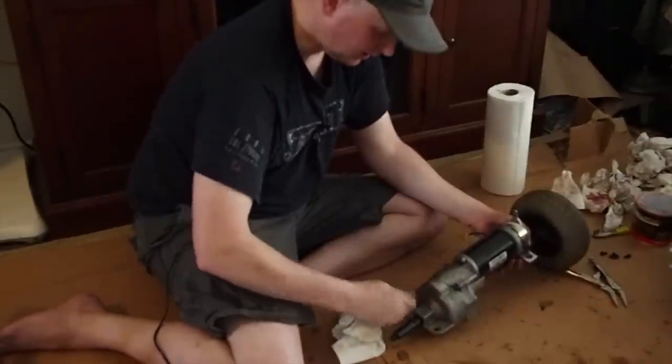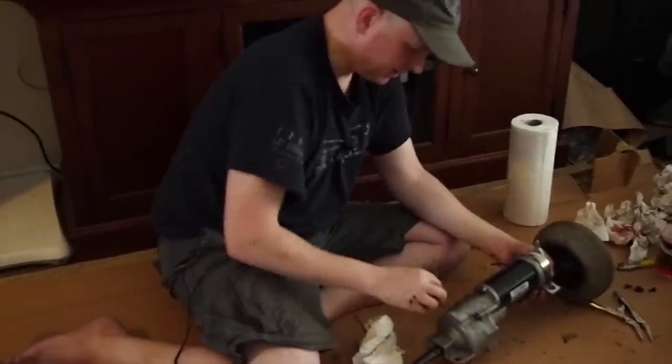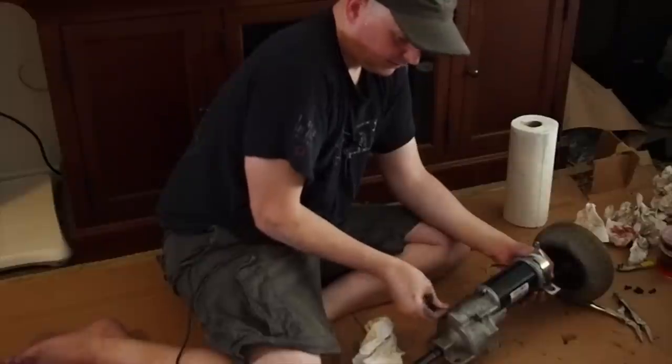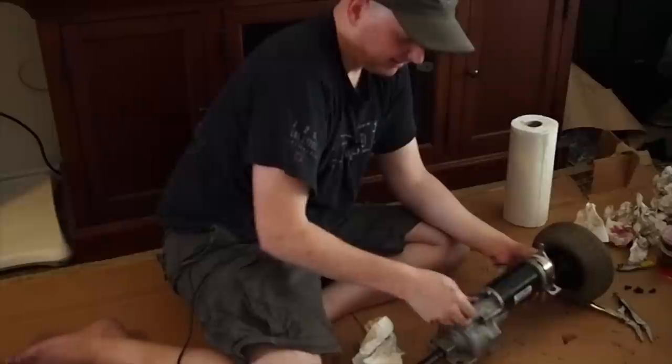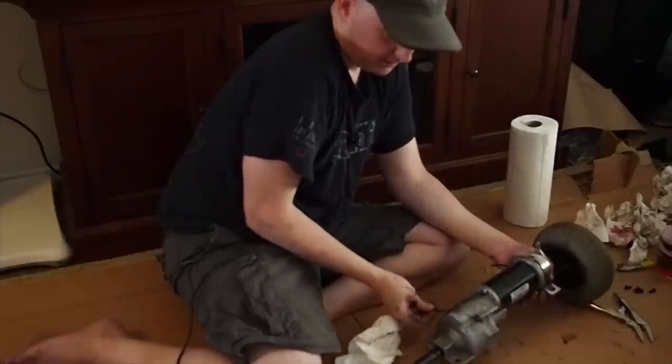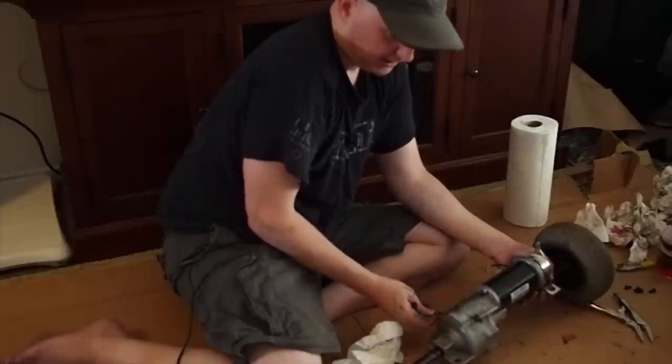Just getting the motor put back on here. This is all very kind of scary because I don't know if we're 100% sure that this is going to work or not.